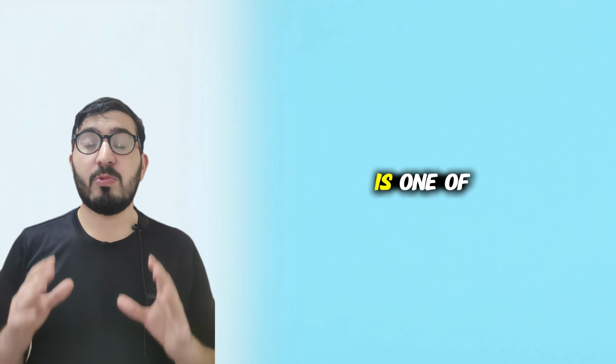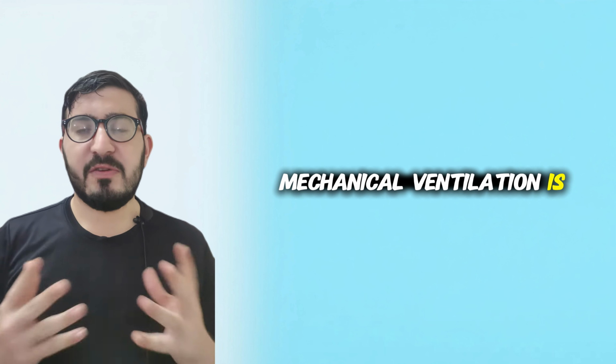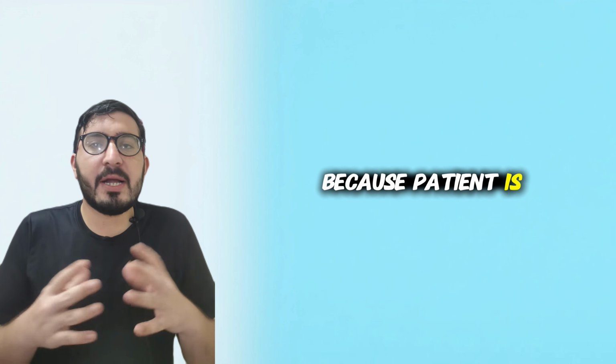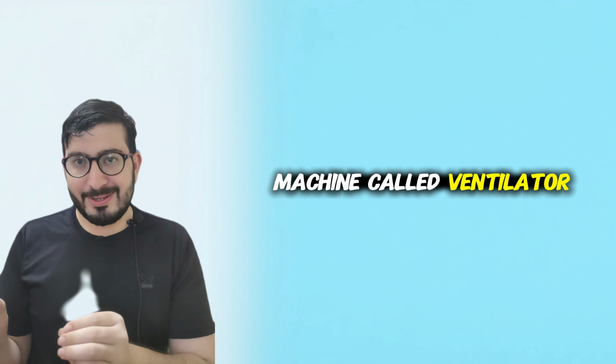What is mechanical ventilation? Mechanical ventilation is considered one of the most important topics of critical care nursing. It is defined as a life support technique where, with the help of a machine, we provide breathing to a patient. Why do we provide breathing with the help of a machine? Because the patient is unable to breathe by himself. For this reason, we use a machine called a ventilator, through a special technique an expert knows.